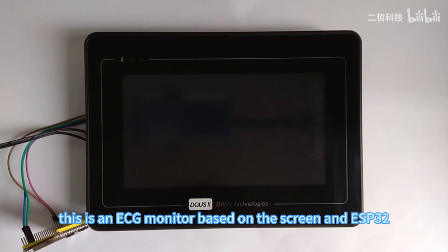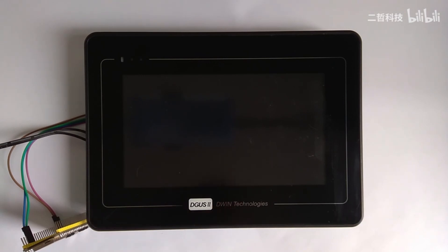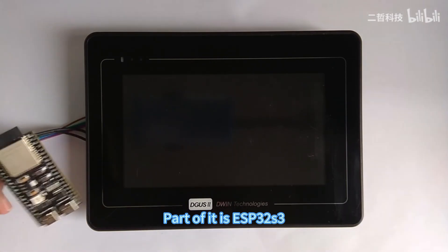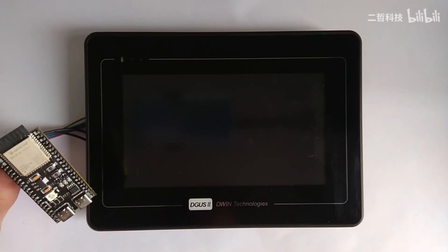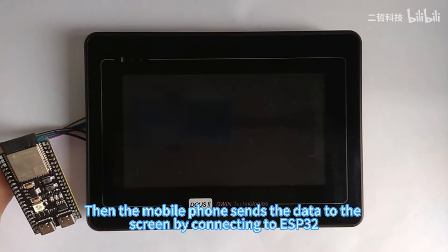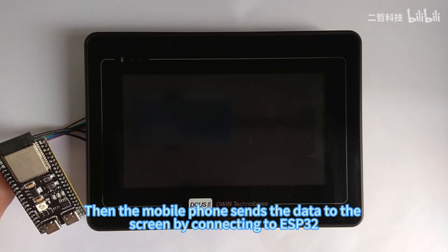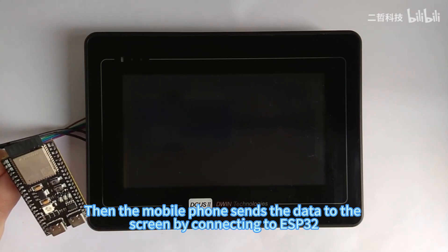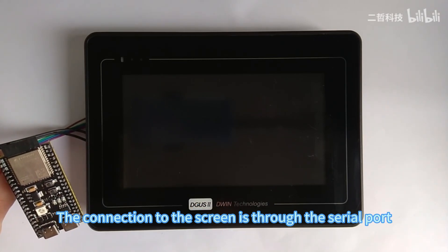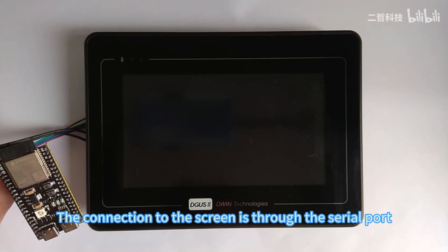Hello everyone. This is an ECG monitor based on a screen and ESP32. It mainly consists of two parts. Part of it is ESP32 S3, which mainly generates an AP. The mobile phone sends data to the screen by connecting to the ESP32, and the connection to the screen is through the serial port.